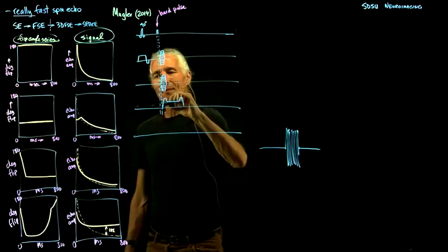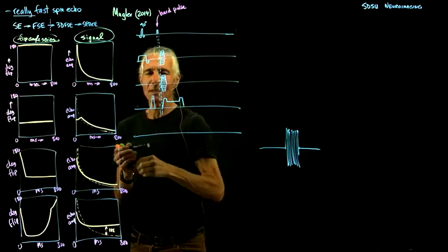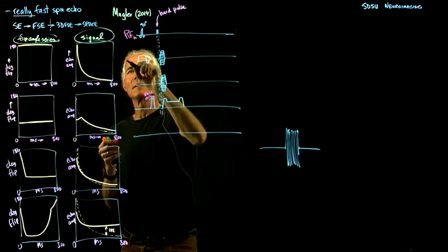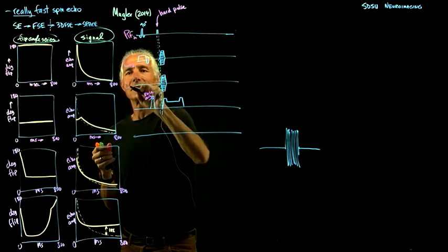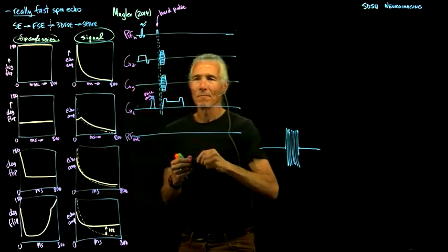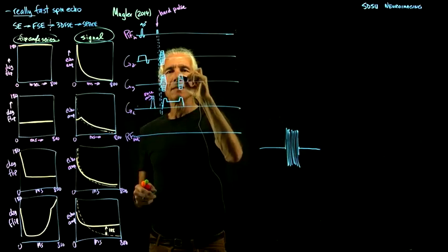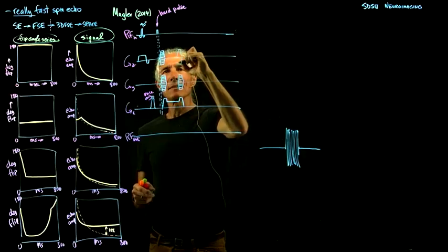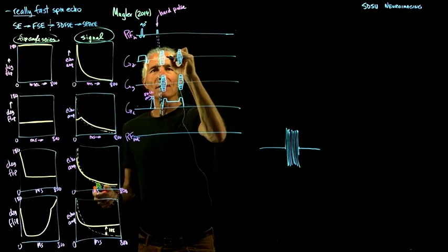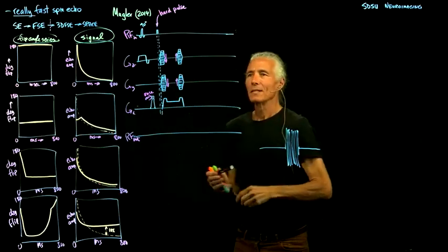And then we've got just a single one that occurs once only with a little bit of extra on it here. So this is once only. So this is RF in the Z, Y, X, RF out. Okay, and then as soon as we finish this, we immediately fix up what we did in the phase encode, because we have to patch up our echoes because we need to reuse them. And so if we were, say, going in this direction, then on the way back we go in the opposite direction.